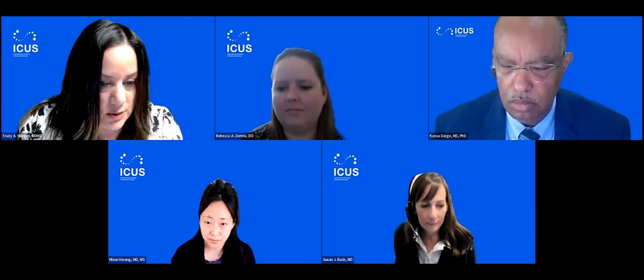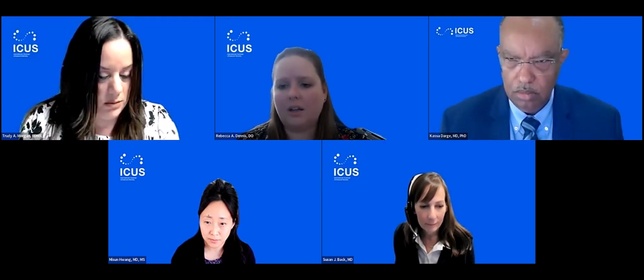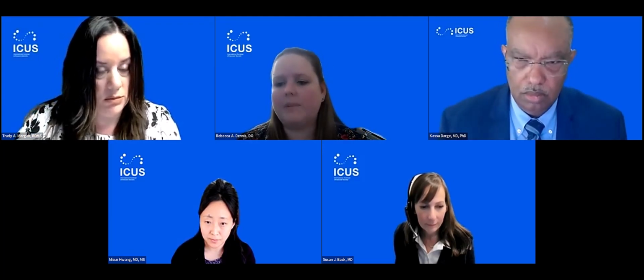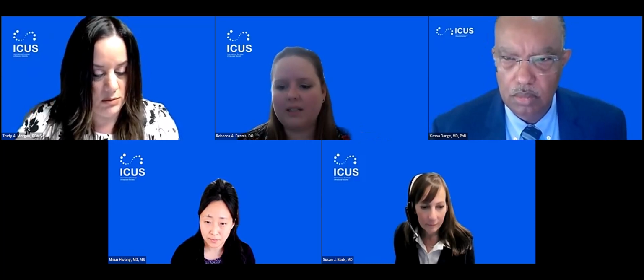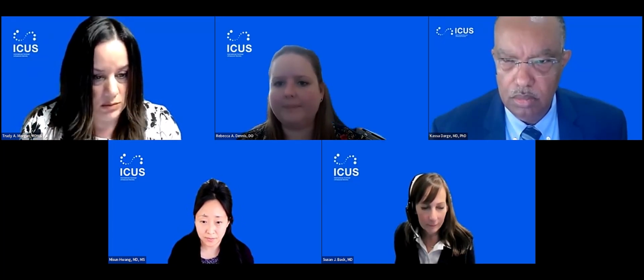Thank you. Also, in your experience, have you had an overall successful interpretation compared to the other modalities using CEUS? Yes. By actually making this lecture, I looked up a lot of either pathology reports or follow-ups, and we're pretty accurate. Sometimes, just like in MR or CT, there are indeterminate lesions. And on contrast ultrasound, sometimes you have indeterminate lesions where they don't follow the book, and either they require follow-up or they do get a biopsy. Or it's some diagnosis that's out of left field. I've noticed our malignancy ones are pretty accurate.